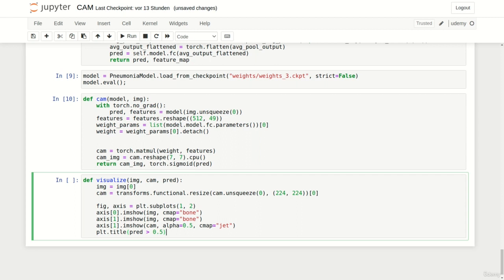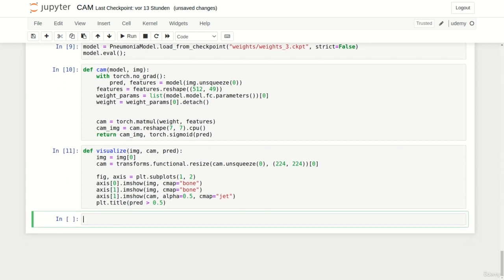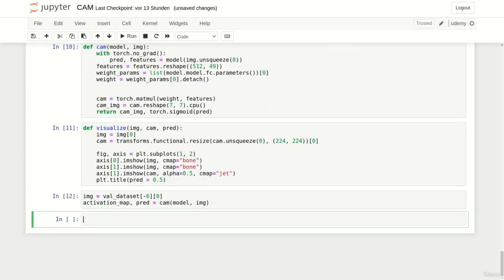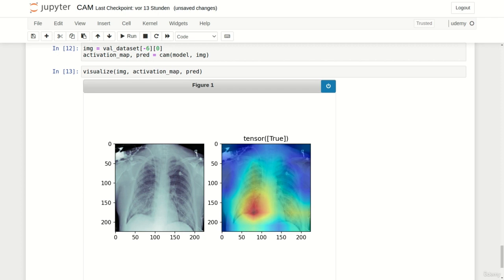Now it's demo time. We use our validation dataset to select a subject at index -6, which is a particularly nice x-ray image. We drop the label, calculate the class activation map and prediction by calling the CAM function, then pass the image, CAM, and prediction to our visualization function. The result looks perfect — we can beautifully see how the somewhat foggy region of the x-ray image has a large impact on the prediction of the network.